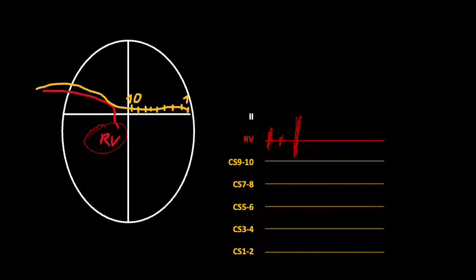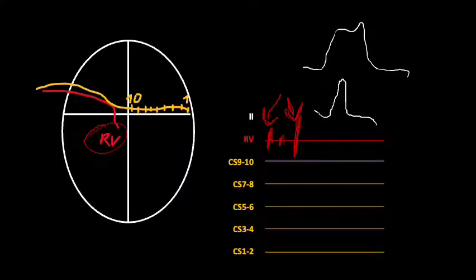ventricular signal. Because in this case, especially with the higher voltage, it's possible that during the pacing we may pace not only the ventricle but also the atrium. So we've got capture in the ventricle and in the atrium. And in this case, it doesn't matter what shape the QRS complex is, whether narrow or broad, we pace the atrium also. So we've got the capture in the atrium.